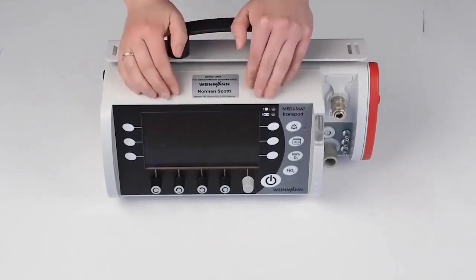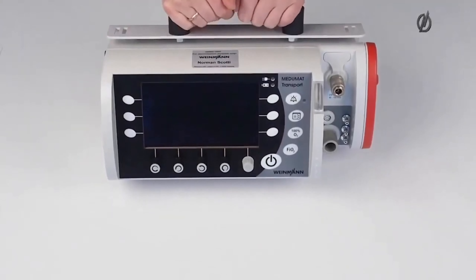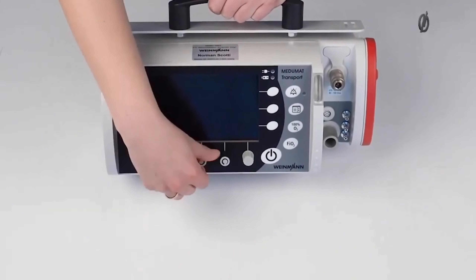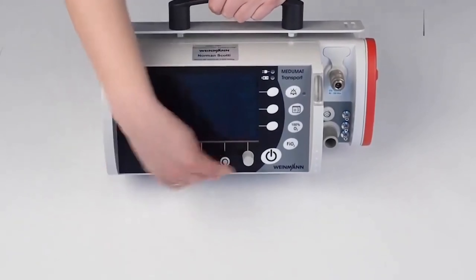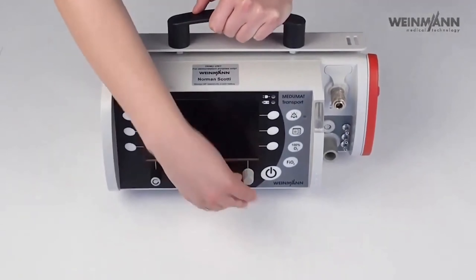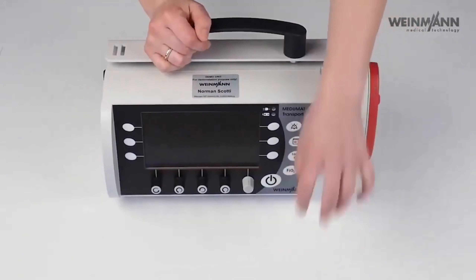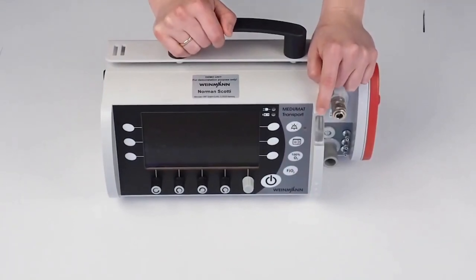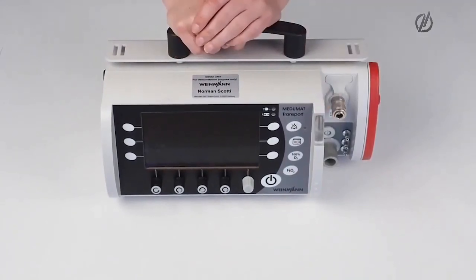Starting with the front side, we have the display here — this is not a touch screen. You can do the settings via the rotary knobs, and this knob is for confirming a setting. We have the on/off button here, and here we have the alarm light which flashes red in case of a high priority alarm.